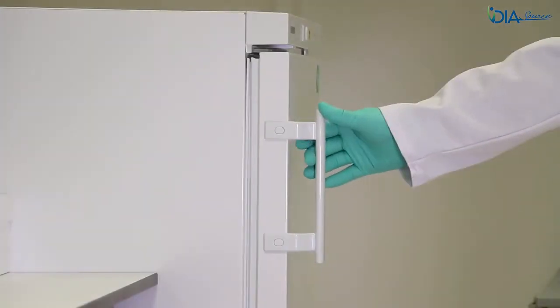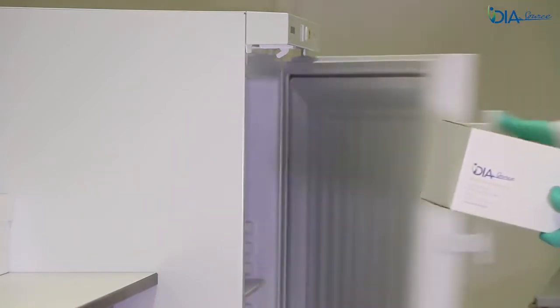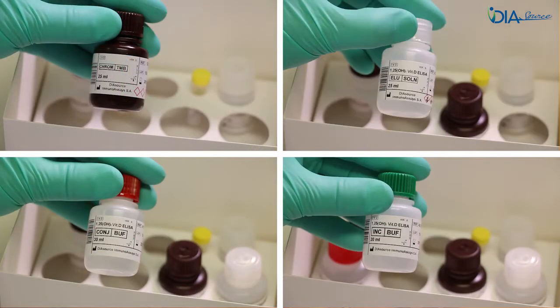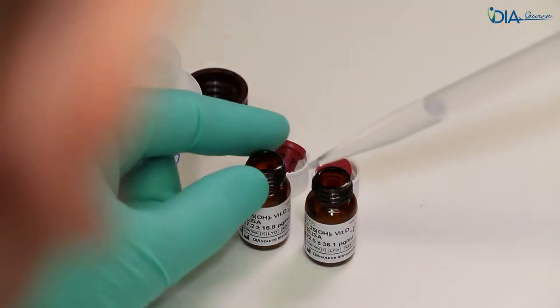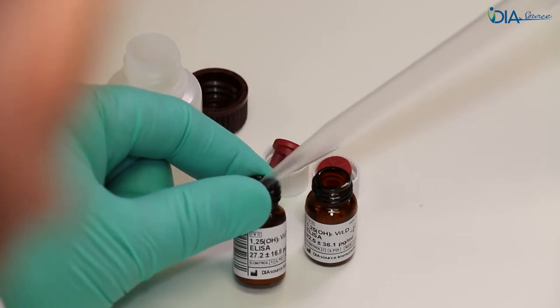On day 1, take the kit box out of the fridge and take all necessary reagents out of the box. This includes the controls, the calibrators, the microplate, the incubation buffer, and the elution solution. Put the remaining reagents back in the fridge. Once at room temperature, rehydrate the controls and let them stand for about 20 minutes.